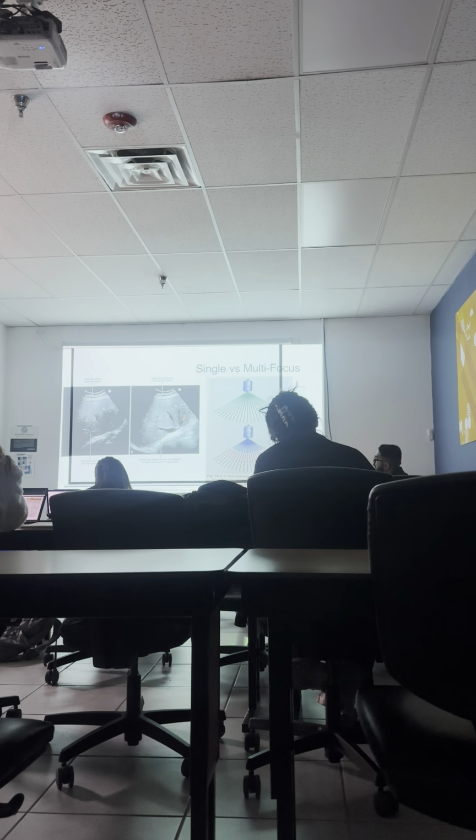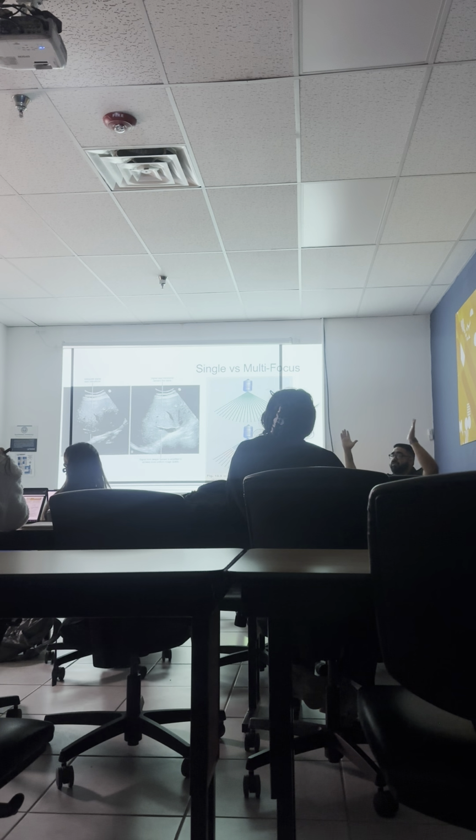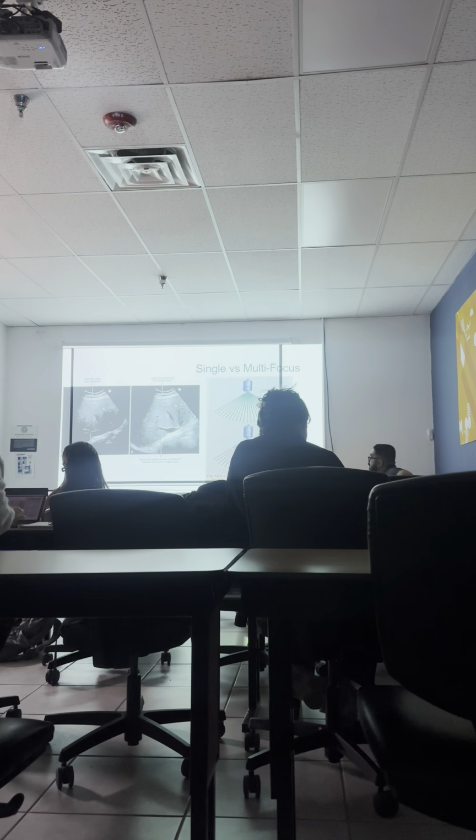But we increase the focal points. We have 3 focal points now. Now we see the hepatic veins. Okay, so what does adding multiple focal points do? Improves the temporal resolution. No, improves lateral? It improves the lateral resolution. Okay, by doing what? Sending out more pulses, narrowing the beam width. It narrows the beam width over a longer distance.